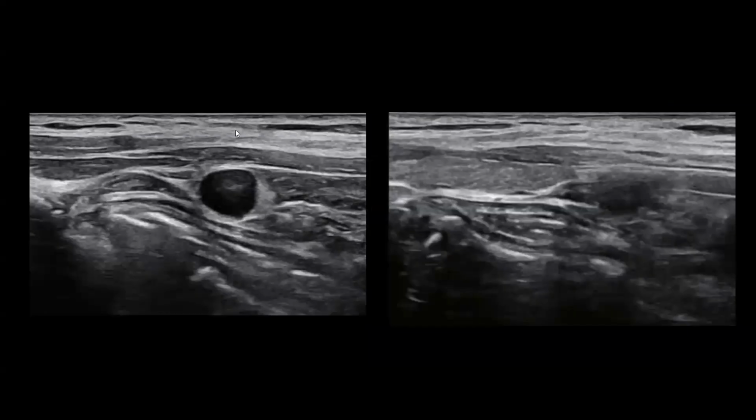A cyst was seen in the lower part of the thyroid gland on ultrasound. If you look closely, you can see an echogenic portion on the periphery of the cyst. The finding raises the probability of parathyroid lesions. Let's look at it in a clip.